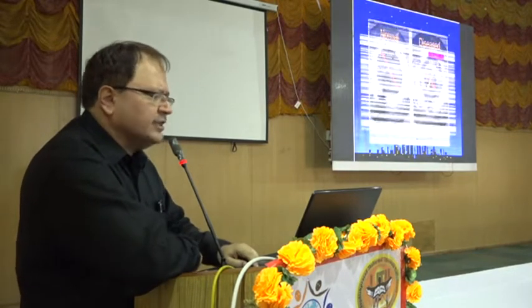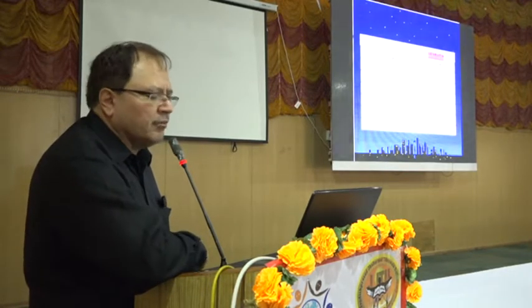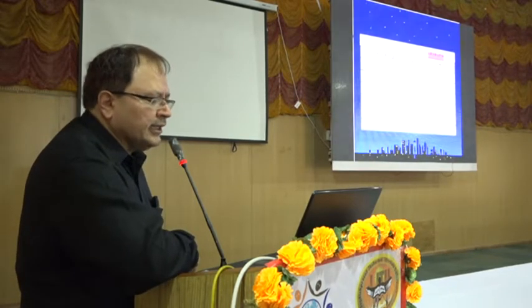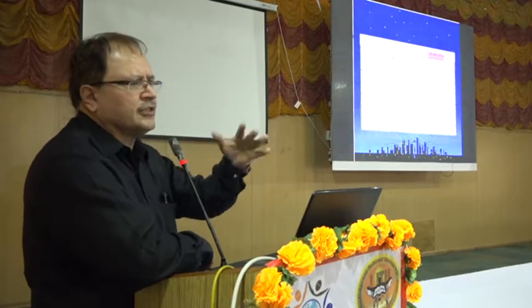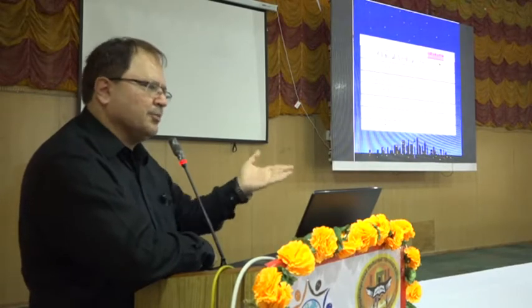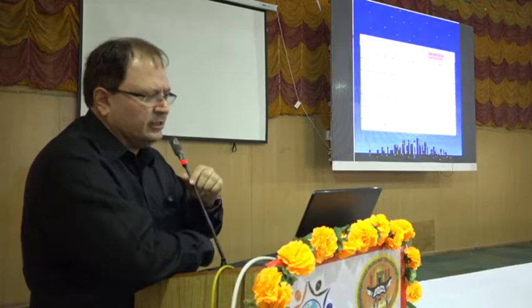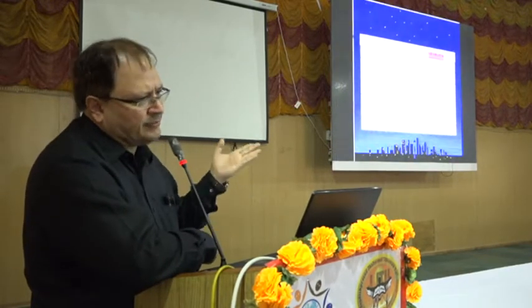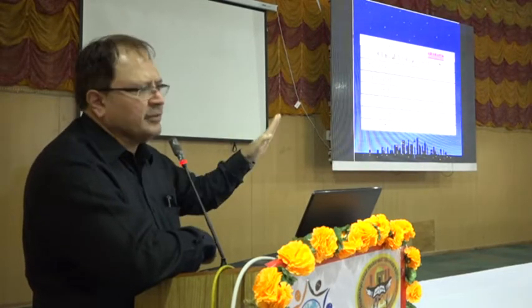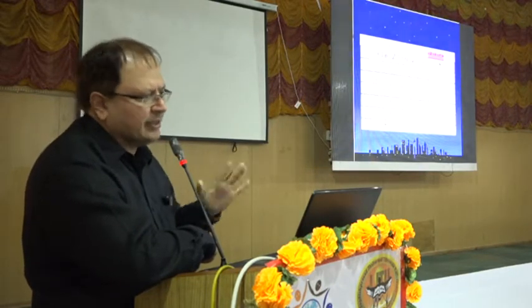What are the indications for the IVUS? IVUS is to be done to see the normal. If a patient has severe chest pain and normal coronary arteries, please go for the IVUS to look for any ulcerated lesions. If a patient has intermediate lesions, suppose a patient comes to you with chest pain, his blocks are 60-70%. Now you have to decide whether you should go for angioplasty or he should be managed medically. The IVUS is the best mode of investigation, which will decide whether you should go for angioplasty or medical management. If IVUS shows the lesion is more than 70%, then you should put a stent. And if it is less than 70%, you should manage with medicine.